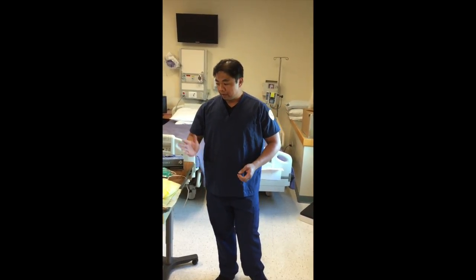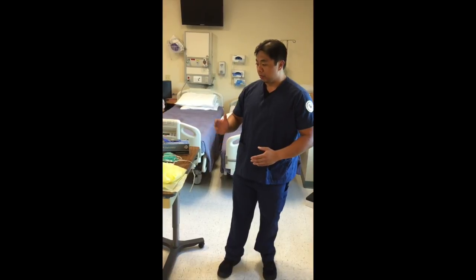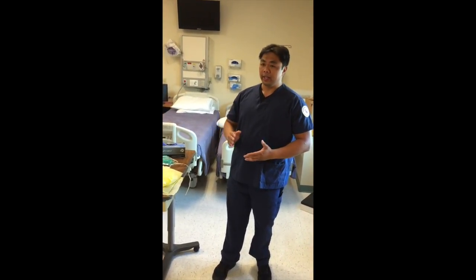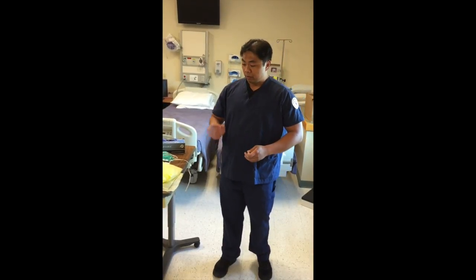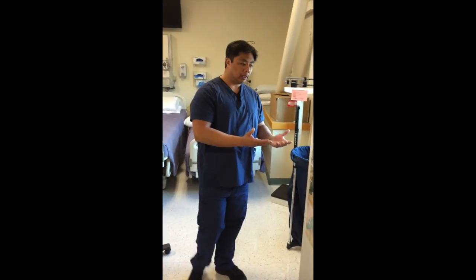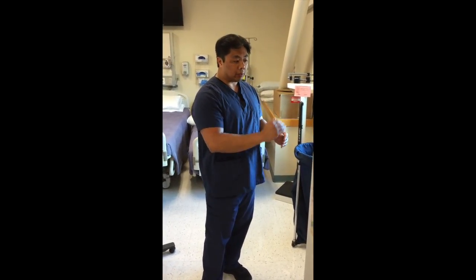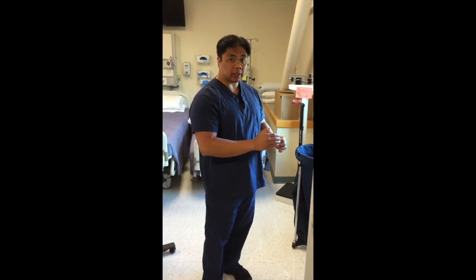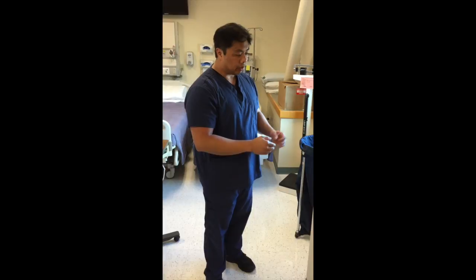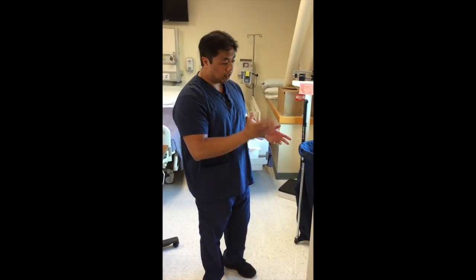So for today, I'm going to demonstrate how you would put on your PPE if you were dealing with an airborne precaution. What you would first do is go up to your patient's room and check their chart. You would see what precautions they are under and what kind of protective PPEs you should be wearing when you enter the room. Looking at the chart, we see that they're under airborne precaution.